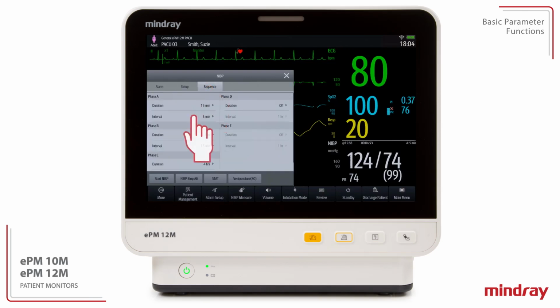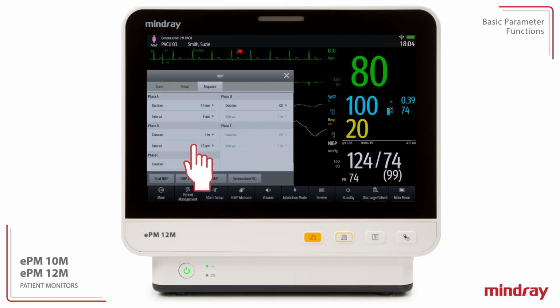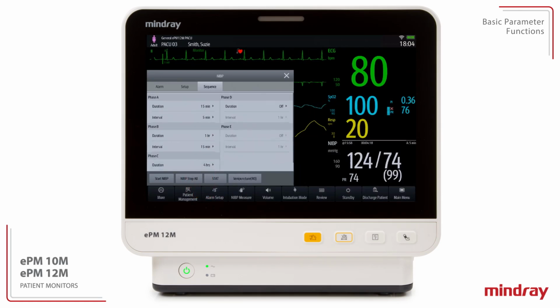For example, the clinician may select an interval of 5 minutes for a duration of 15 minutes for Phase A, followed by an interval of 15 minutes for a duration of 1 hour for Phase B, and an interval of 1 hour for a duration of 4 hours for Phase C. Up to 5 phases may be configured within the sequence. Select Start NIBP to initiate the sequence.